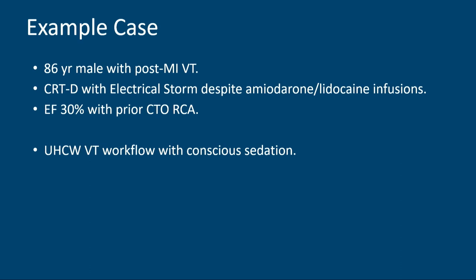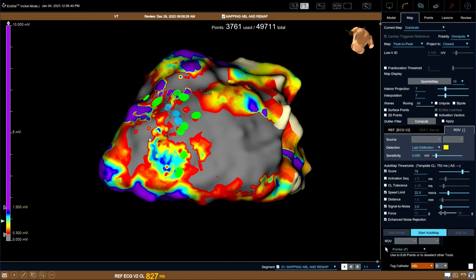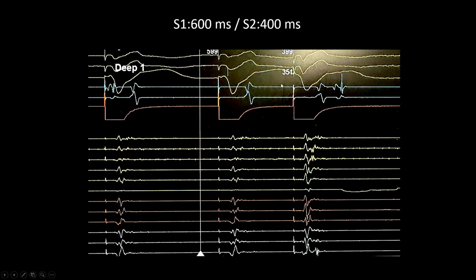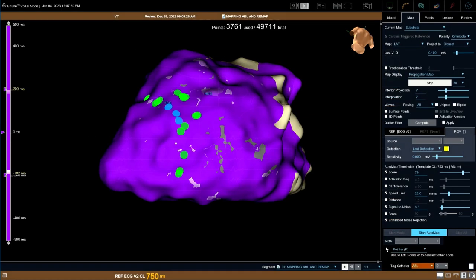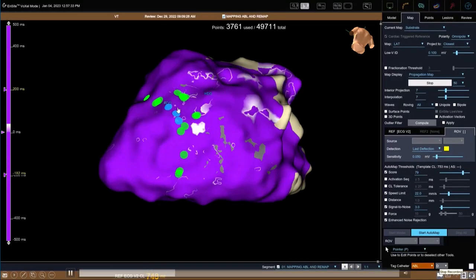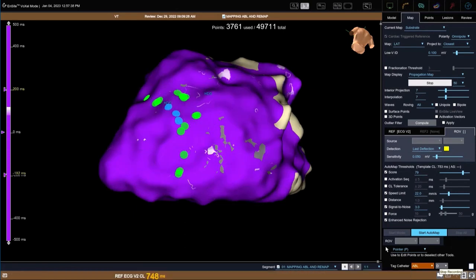An example case: an 86-year-old male, post-MI with a CRTD, in electrical storm despite amiodarone and lignocaine infusions, with 30% EF and prior occlusion of the RCA. The substrate map shows an inferior wall conduction channel running from the lateral wall to the septum. Green and blue tags mark manually tagged decrementing potentials. With S1 at 600 milliseconds and S2 at 400 milliseconds, there is very little fractionation with S1, but with S2, the signal clearly decrements—and the green tags highlight what looks like a channel.